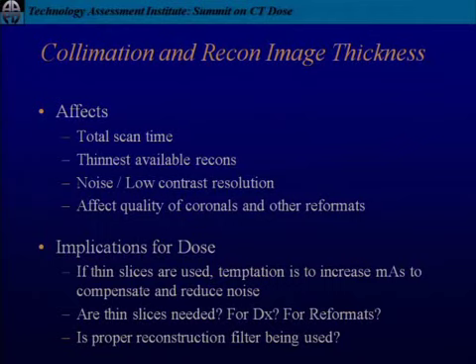The other one that I'm hearing a lot is slice. I have a pet peeve about slice. It gets used to mean all kinds of different things. If you mean image, say image. Otherwise, people are using it to mean beam width very often. So let's just, everybody try and be really precise about what we're saying. I think that means no one's allowed to say slice anymore. And apparently my slides have to be revised before they're posted.